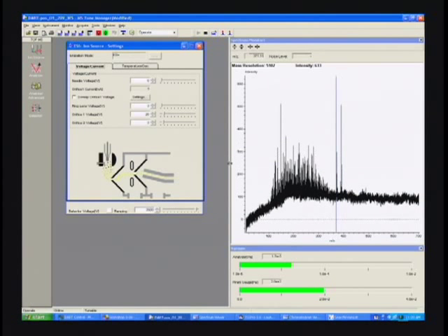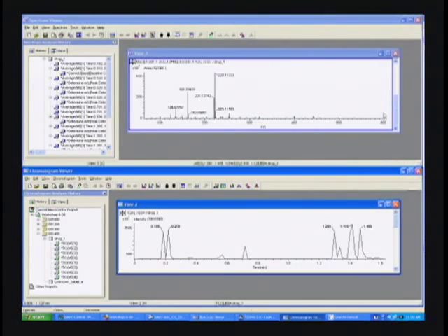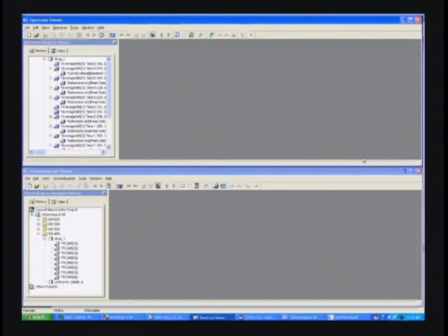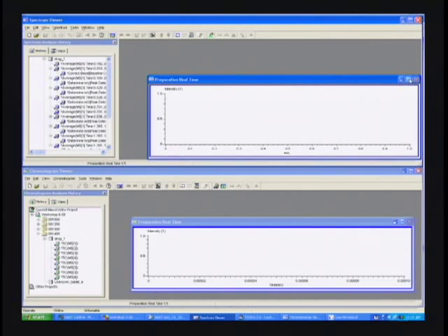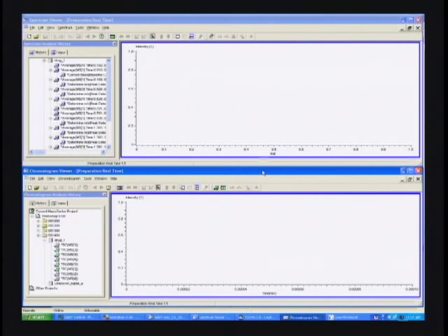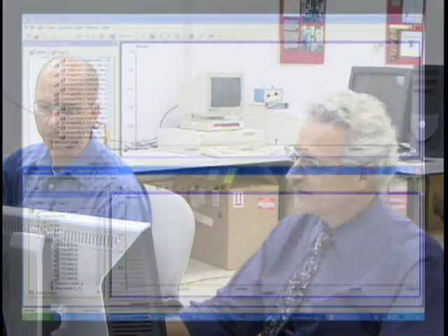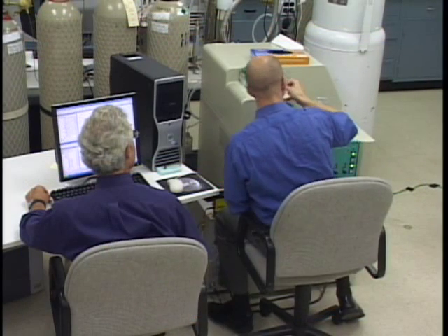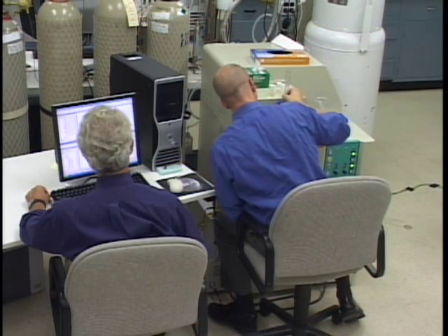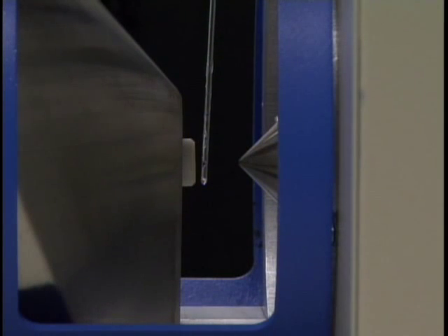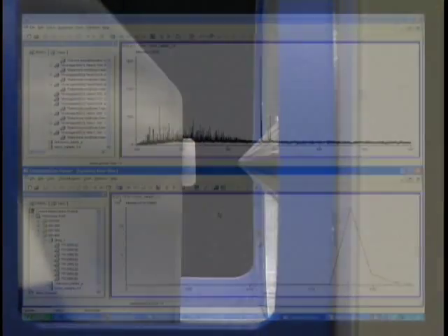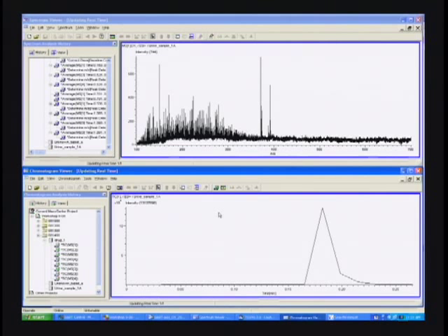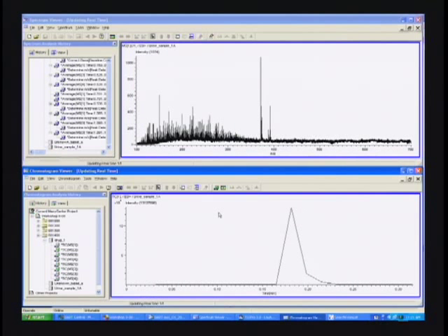Now when the start button comes up, we'll see if I have any more practice at sample introduction. The first thing I'm going to put in is the PEG standard for calibration. I'll drop that down in. We're going to collect all these samples into the same data run. We've got a PEG standard in there. We'll put a PEG standard on the end.